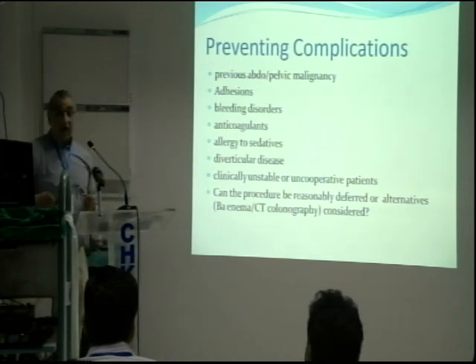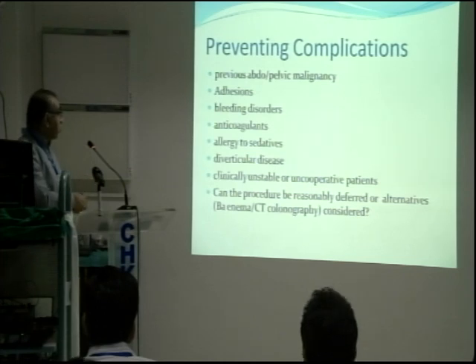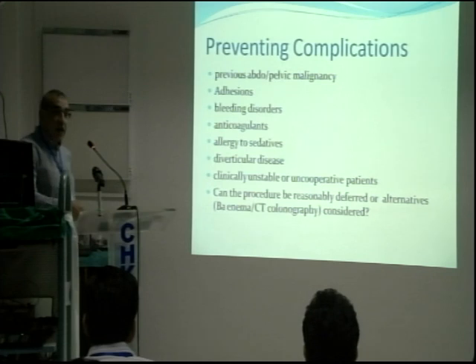And always ask the question, would another procedure be acceptable? And the other procedure is CT colonography. We don't do barium enemas now. It's out, right?